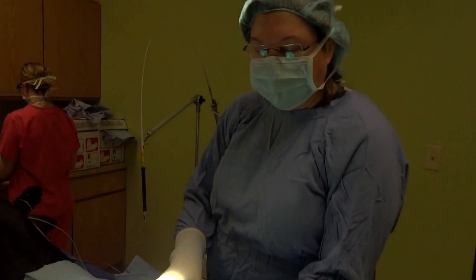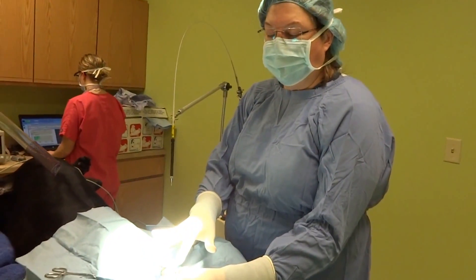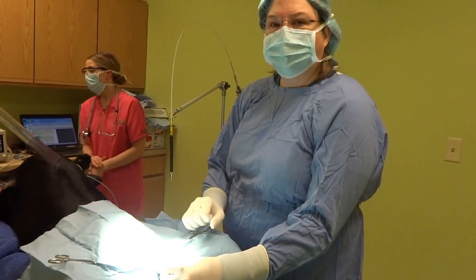As you can see, there is no blood in the incision when we use the laser.